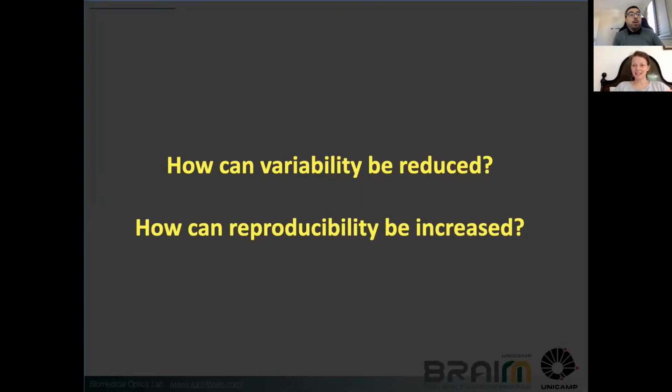It's definitely more of an issue if you're doing a cognitive task, like the reading task, that can have a large habituation effect, mainly if you're using the same passages, right? But not with a very simple motor task. I wouldn't expect that habituation could play an important role in this.